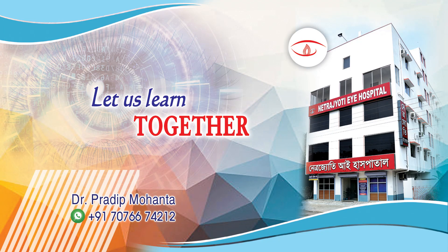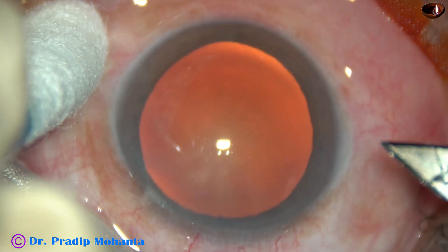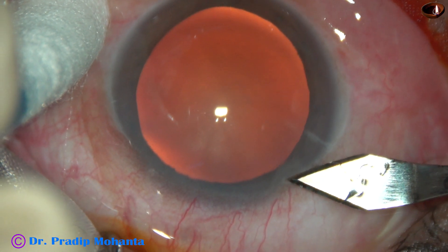Friends, welcome to my workplace at Hrana Ghat, West Bengal, India. Let us observe this totally unedited routine phacosurgery.